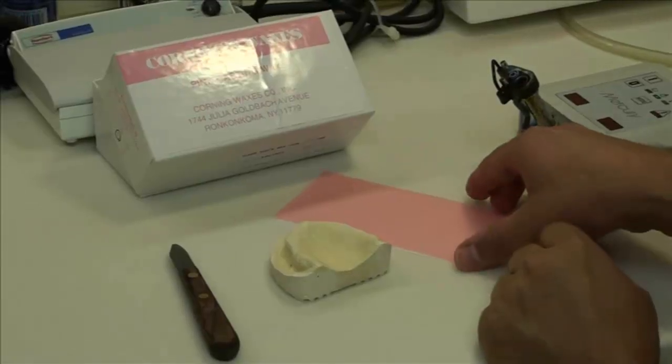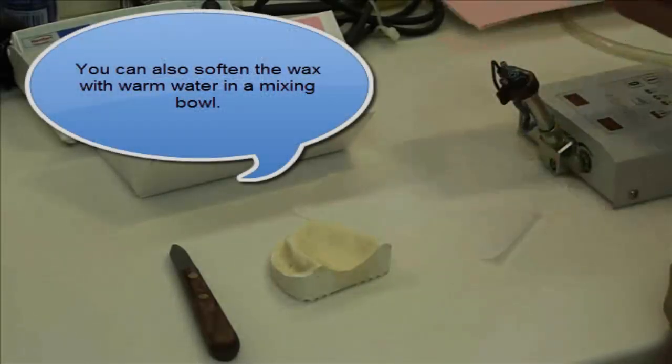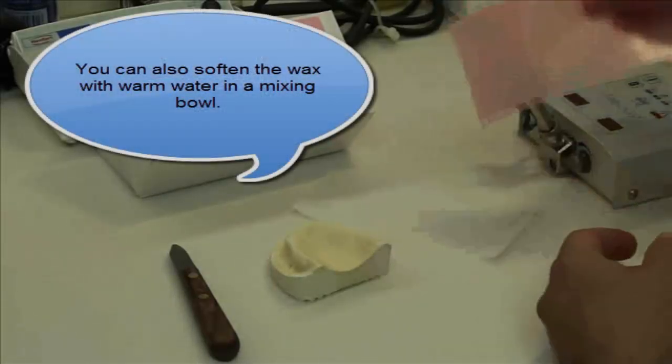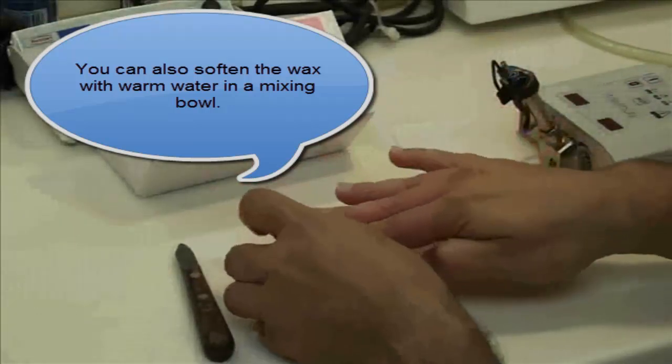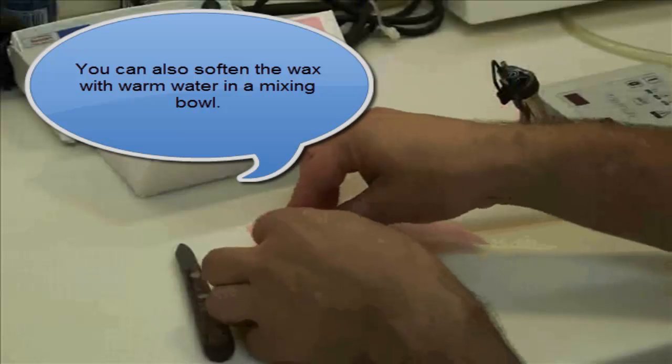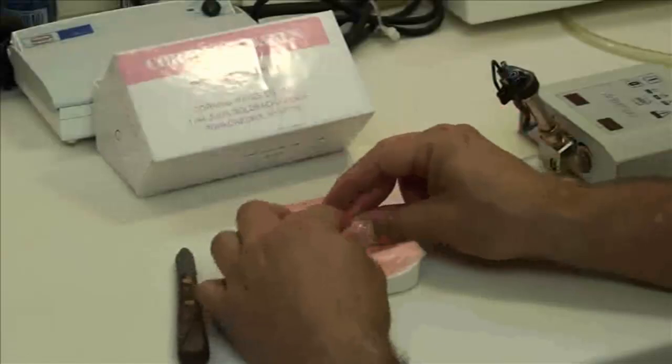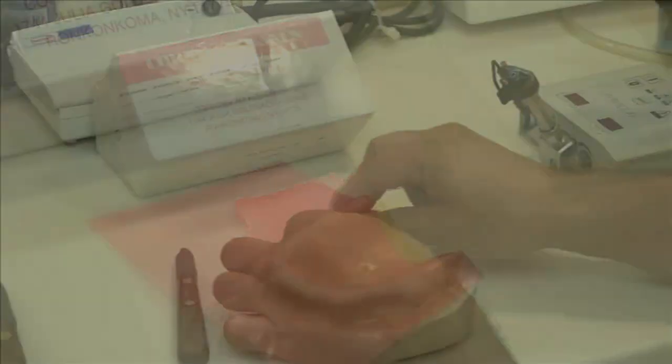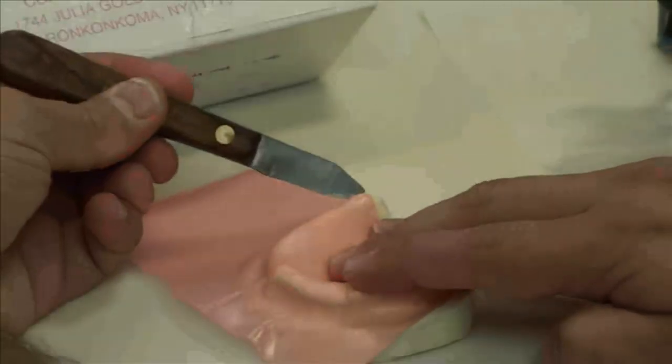Adapt the FiberForce spacer wax to the model. If the wax is softened through the use of a flame, a double thick layer of wax may be preferred to create the correct amount of space, as a flame can cause the wax spacer to thin out too much. Softening the wax with warm water will reduce the chances of over thinning the wax. Trim the excess wax to complete the spacer.